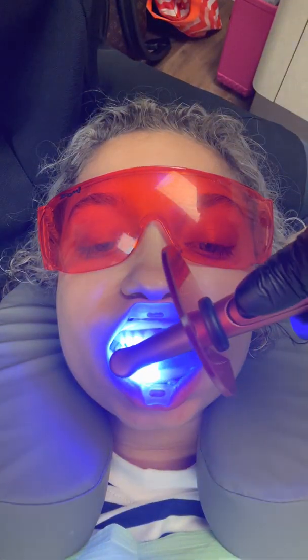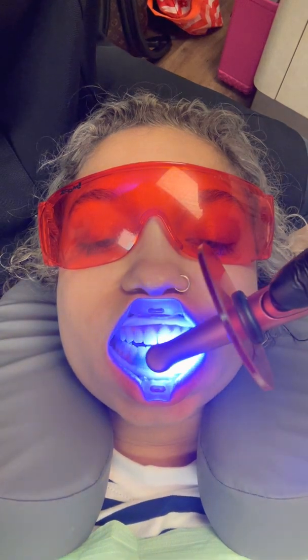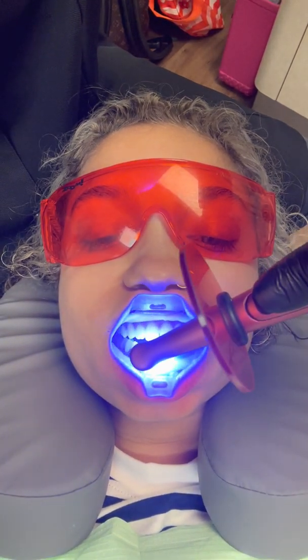Some practices will try to use one syringe for top and bottom. I buy this in bulk because I do not want to do that. You'll see in a minute that I'm basically going to be using one syringe for the lower and one for the top — and again, only doing two or three teeth at a time, because it's spongy. See how it wants to move? I'm going to cure that, but see how we're connecting it.